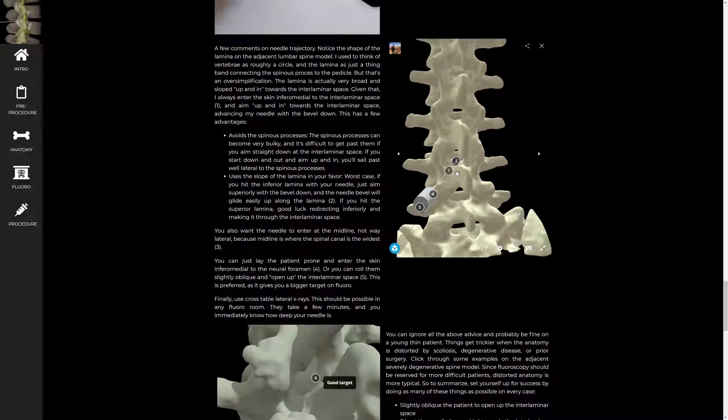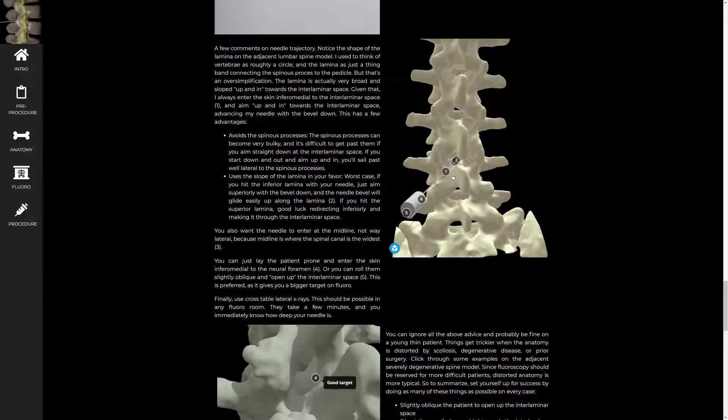I'm on the lamina. I just have to direct up and it should do that without any problem and you'll slide right into the spinal canal.